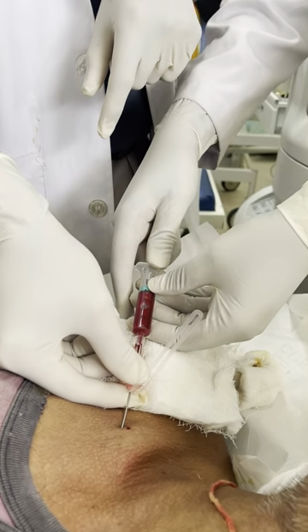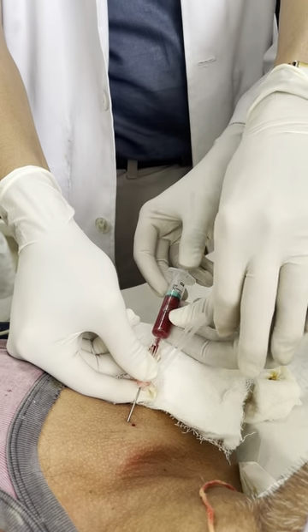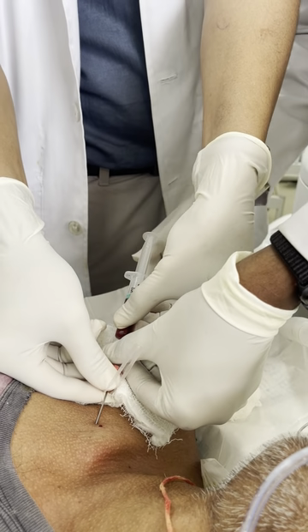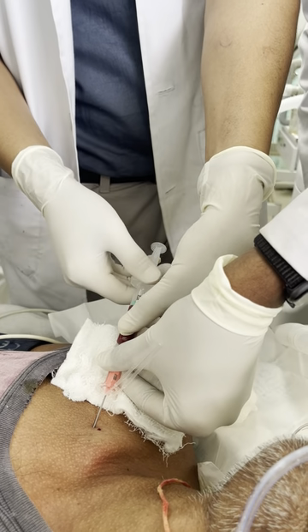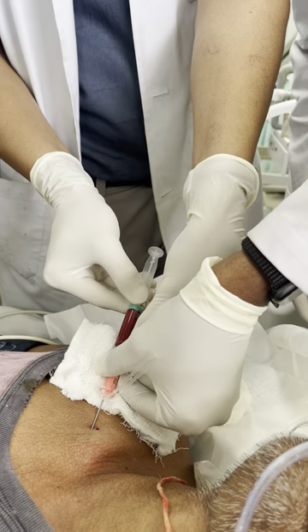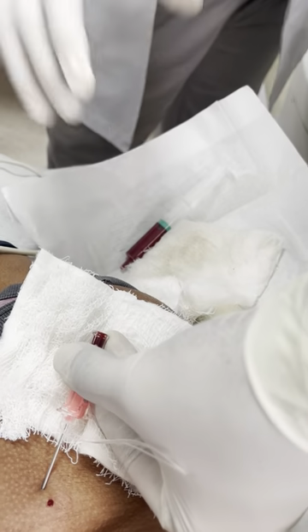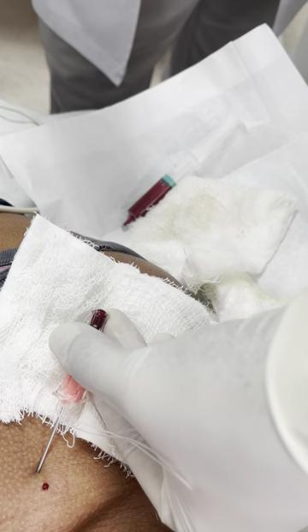This is the flow. Now you will hold this. You will hold the finder with your good fingers, two fingers below and thumb above. Don't let it move. Then you see the flow. Hold it tightly. Check whether the flow is like vein or like artery. It appears to be like vein, because the flow is there, but not a gush.